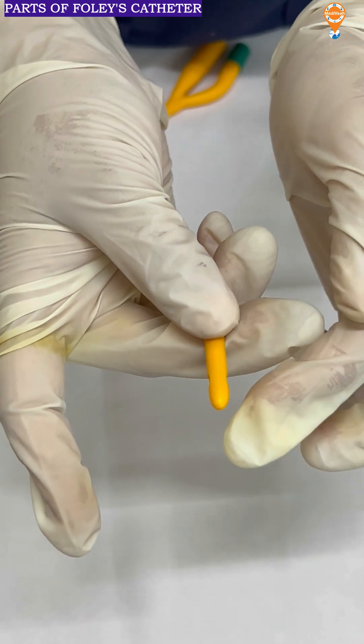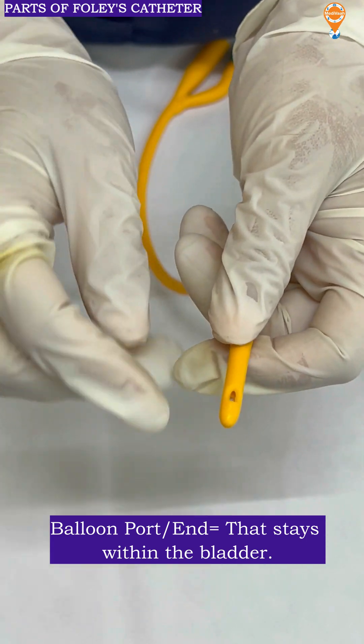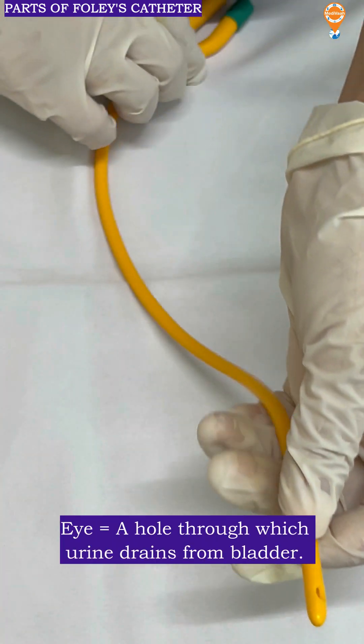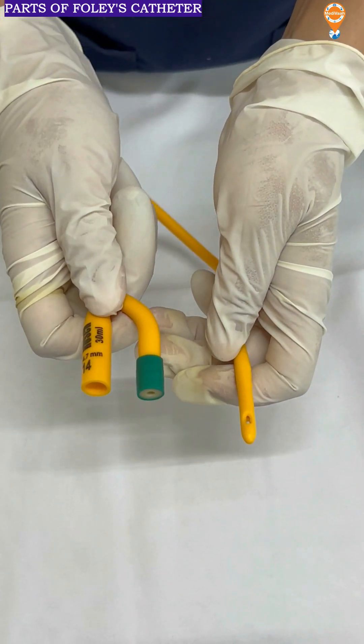This is the balloon end which stays inside the bladder. Here you can see the eye which is present through which the urine is being drained out through the connector port and it is getting accumulated into the urine bag.